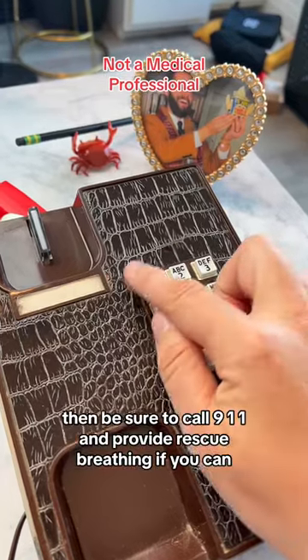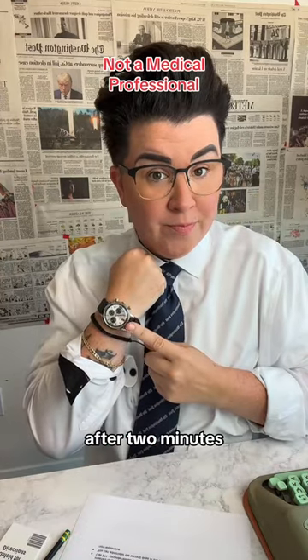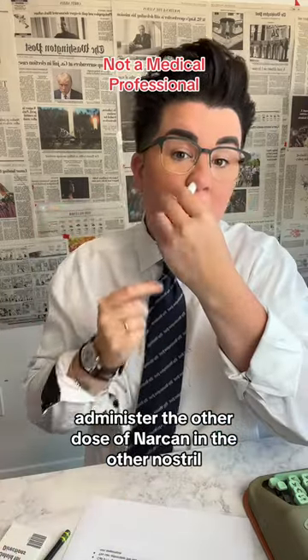Then be sure to call 911 and provide rescue breathing if you can. After two minutes, if the person is still unresponsive, administer the other dose of Narcan in the other nostril. And now you know.